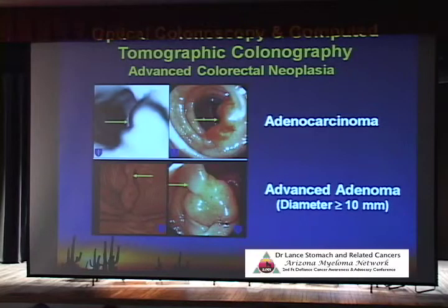You can actually pass a current through that wire, and then that polyp drops off. And so then you can remove the polyp. Nearly always by doing that, that's all that the patient will need. And then that polyp obviously isn't going to go on to become a cancer like at the top.